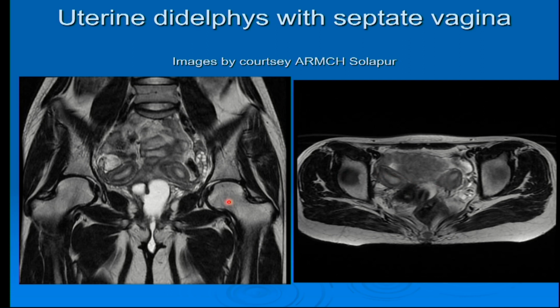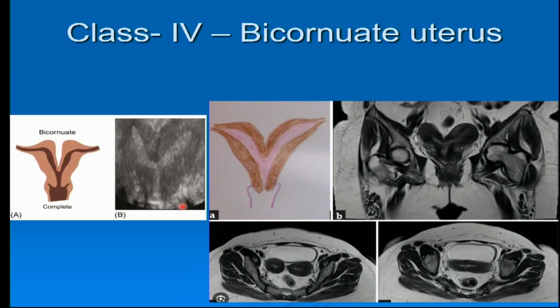This is a case which we have diagnosed, and on MR without contrast there was only didelphys uterus, but when the contrast, that is water or jelly, is pushed into the vagina, you can visualize this longitudinal septum very well. It's our duty to give the location, length and thickness of the septum, which helps the clinician plan the therapy.